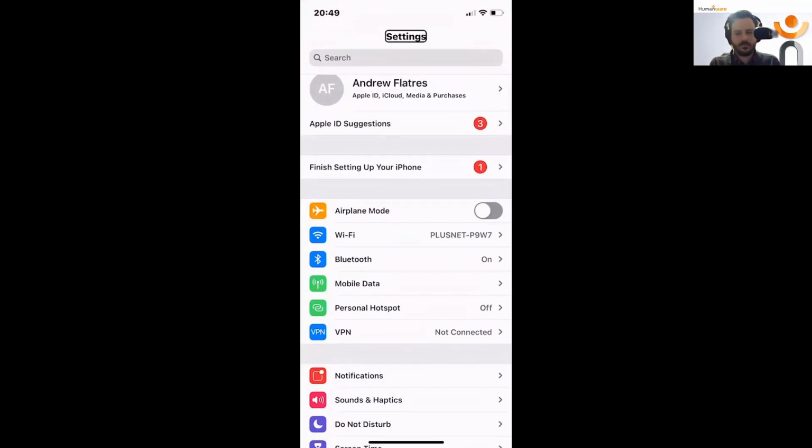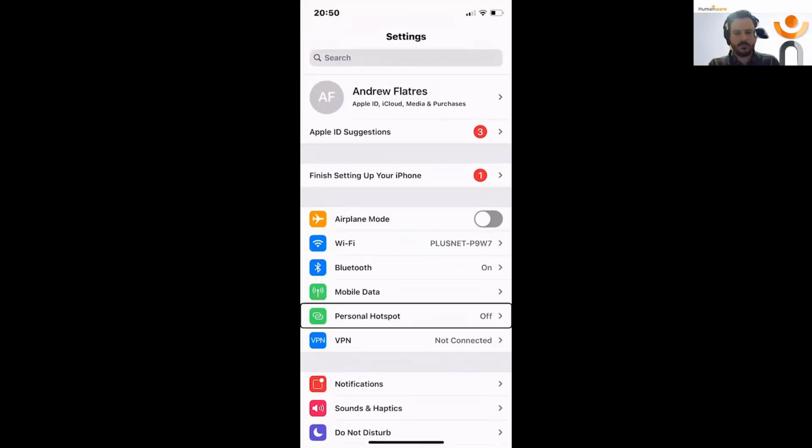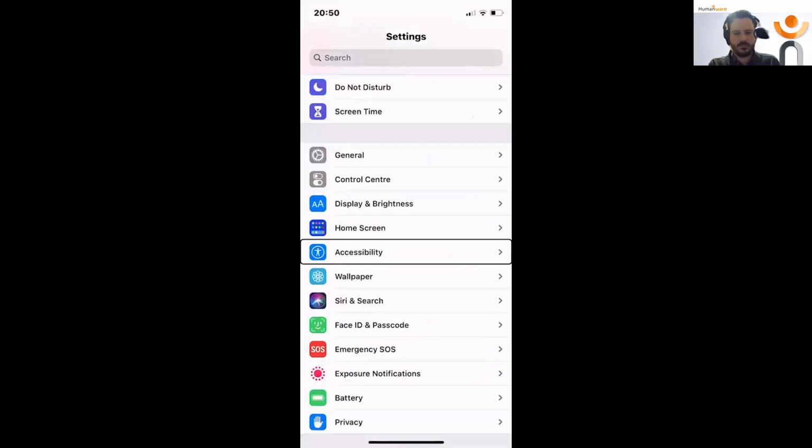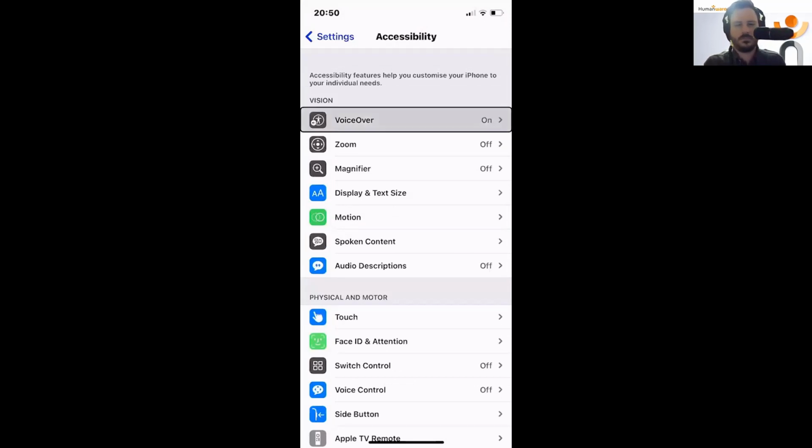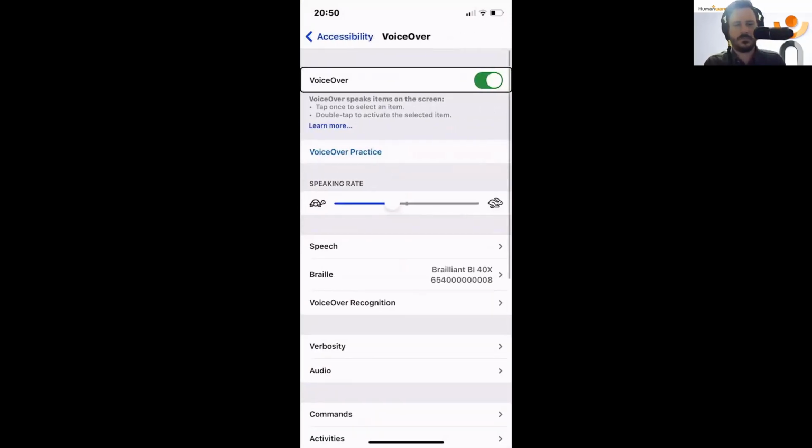So I'm going to navigate to accessibility at this point. So again, accessibility: outer thumb keys to accessibility, press the cursor key to select. Now within accessibility, I'm going to navigate to VoiceOver using my thumb keys, and press the cursor key to select. Now within VoiceOver, there should be an option called Commands. So I'm going to navigate to Commands.